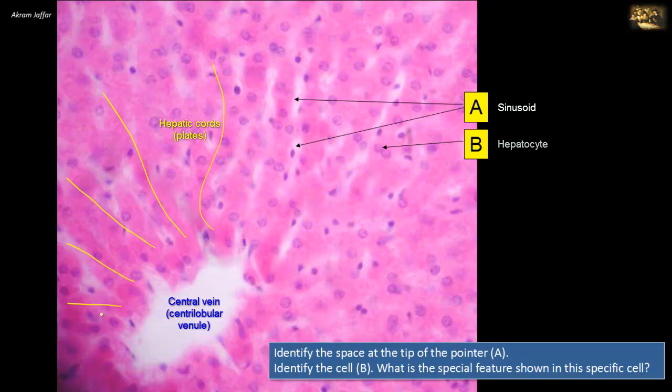Cell B is part of the hepatic cord radiating away from the central vein, located between sinusoids — it is a hepatocyte. Hepatocytes are large polyhedral cells with a round, centrally placed nucleus. The cytoplasm is darkly stained because of their numerous organelles. The specific feature of this cell is that it is binucleated, which is a common feature of hepatocytes in a normal liver. You can see another binucleated hepatocyte nearby as well.